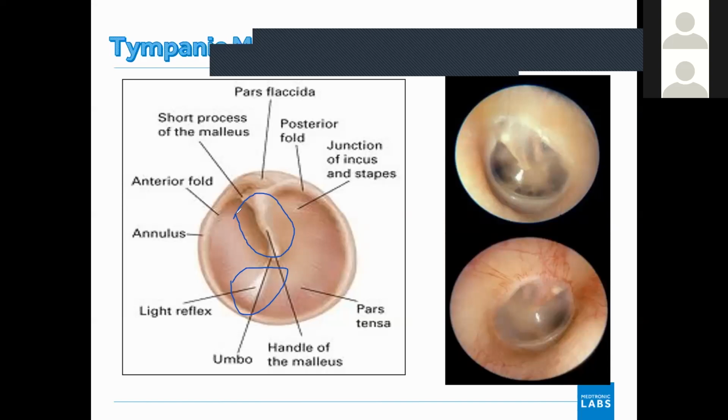So at that time, once the data is uploaded in the web portal, our manager has to cross check the details. If there is some mismatch between the captured picture and the entered data, then we can change it. Moreover, sometimes when we are working in the field, we can identify which one is the left ear or right ear. But once we start doing the analysis in the web portal, we have to consider all these things, then only we can identify.